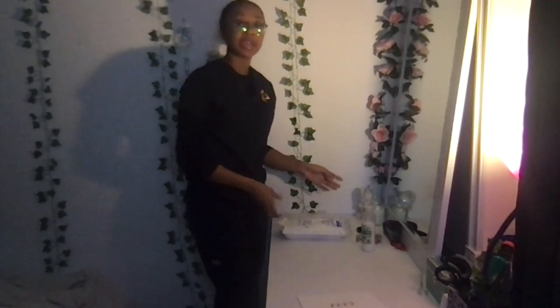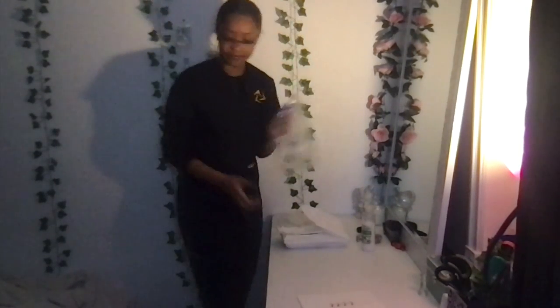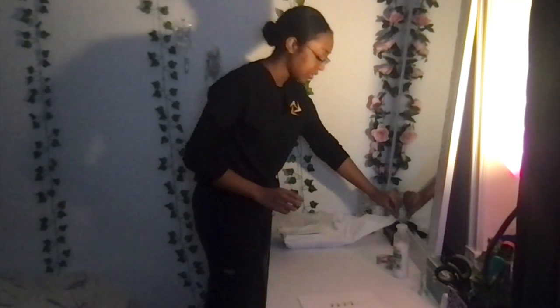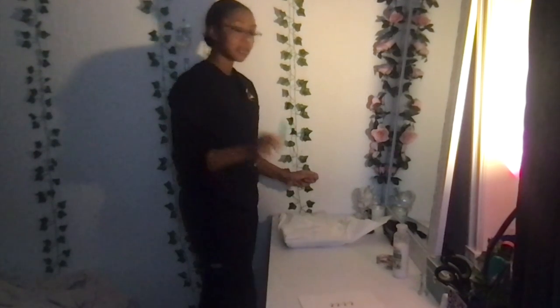Okay. I perform hand hygiene for 15 seconds, and then I can open my dressing change kit. Put that inside, and I can touch my 1-inch border with my clean hands, and I can touch this as long as I don't touch the tips of the tongs.